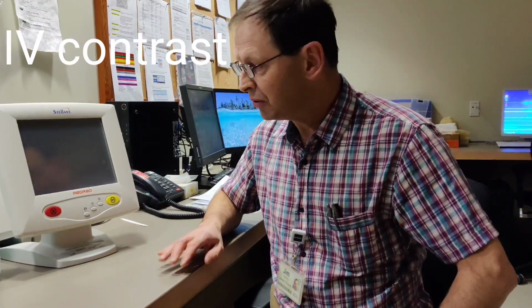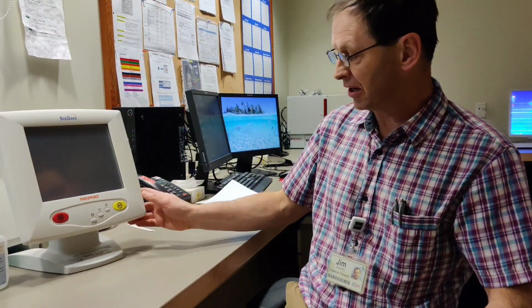Today's video is about IV contrast injection in the CT simulator. So we're going to start out by going over the MedRad console and how to control and operate that. The first thing I'm going to do is turn it on by pressing the button on the side here.